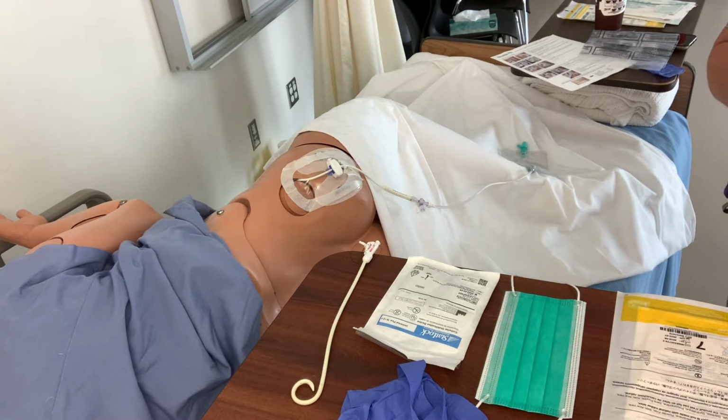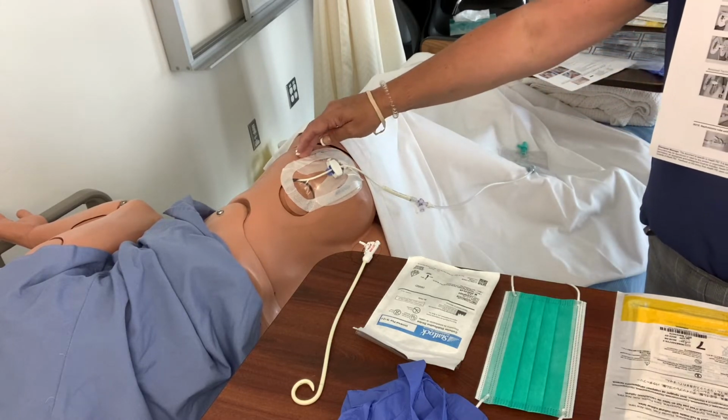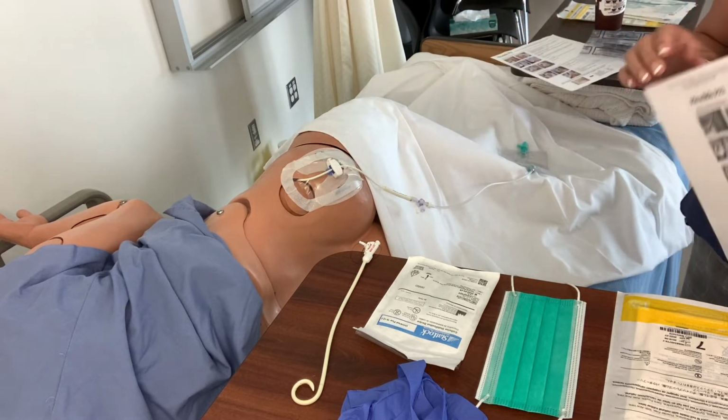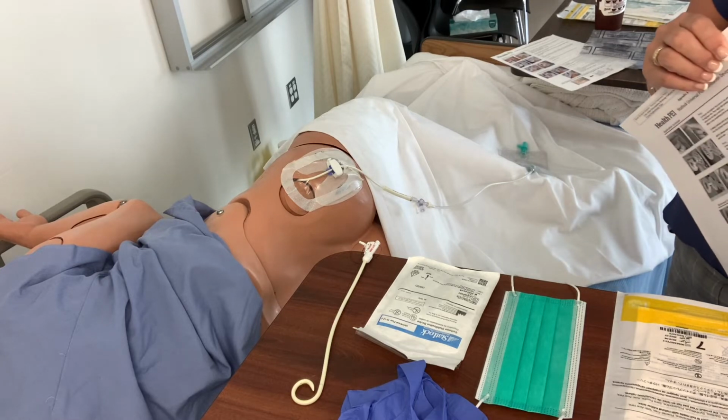Please be aware that if you are in a different province or a different institution, you would be required to follow their policy and procedure, but I'm going to use this as a reference. My patient here has a percutaneous catheter in his flank area, and it's 7 days old, so the dressing is now due to be changed. That's typically when it's changed, or if there is any drainage or any lifting of the dressing.